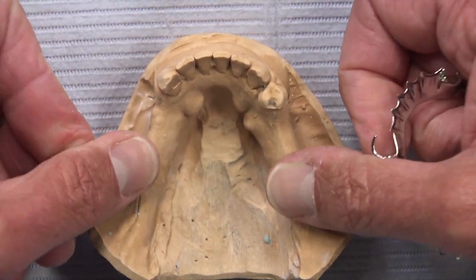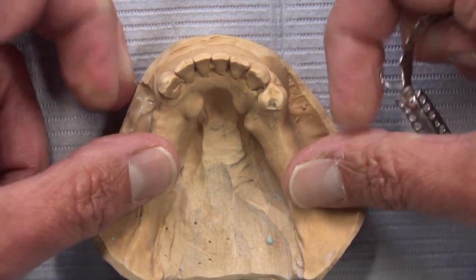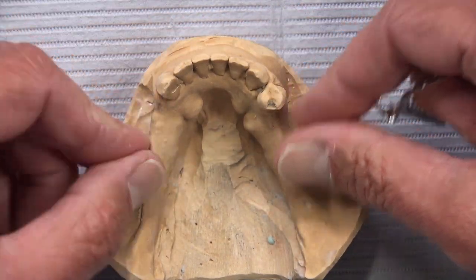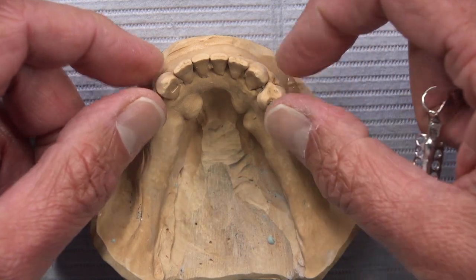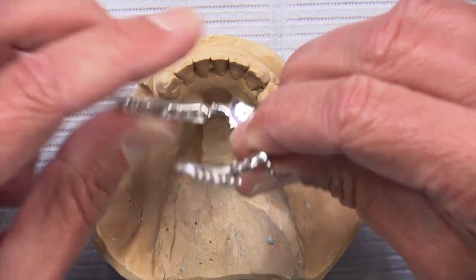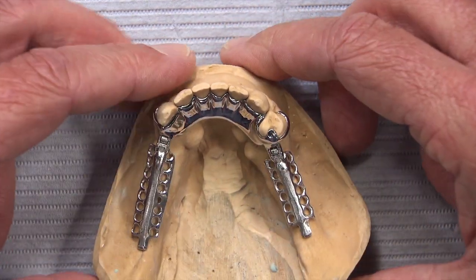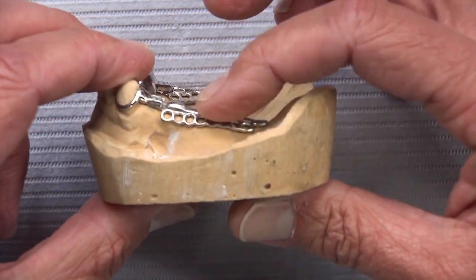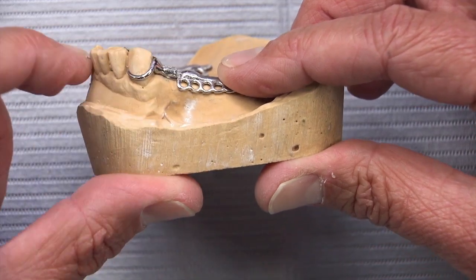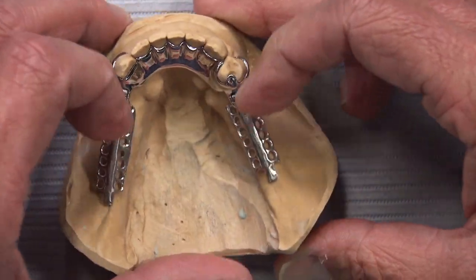Typically in a Kennedy Class 1 situation with bilaterally edentulous areas, when the patient chews down without a stress breaker, we get rotation on the abutment teeth that tends to force them in a distal direction. On a tooth-and-tissue-borne partial like this, if it's a rigid unit, the teeth take the majority of the stress. But with a DE hinge, we transfer a lot of that stress — generated during function — through the stress breaker to the edentulous ridge, sparing the anterior clasped teeth.